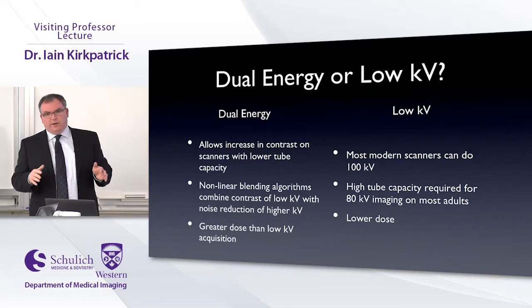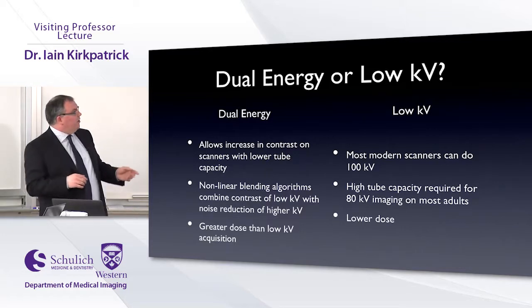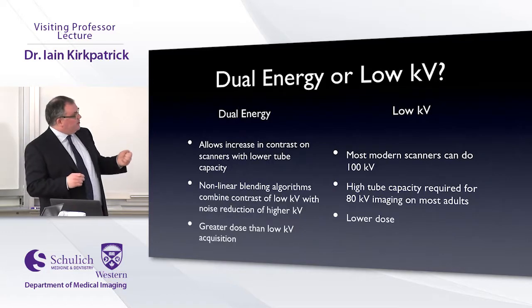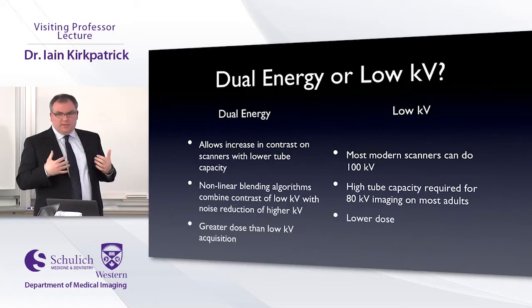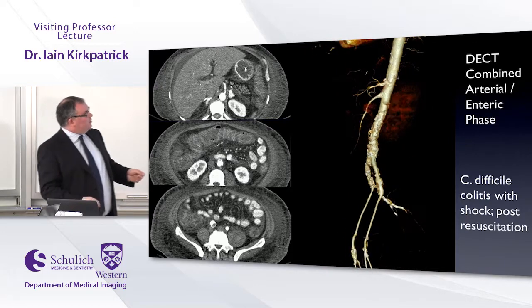GE is working on theirs, and they say it's gonna be out any minute, but it's not actually on the market yet, but it probably will be pretty soon. And that works out really well. It gives you a really bright iodine, but it doesn't actually give you a big hit in image noise. So just a couple of examples of what these look like.